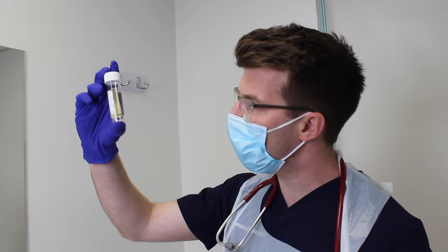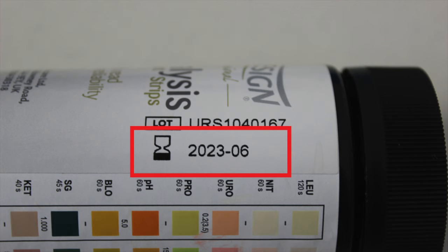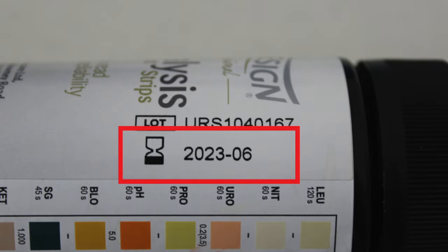Inspect the color and clarity of the urine. Check the expiry date of the urinalysis dipstick.